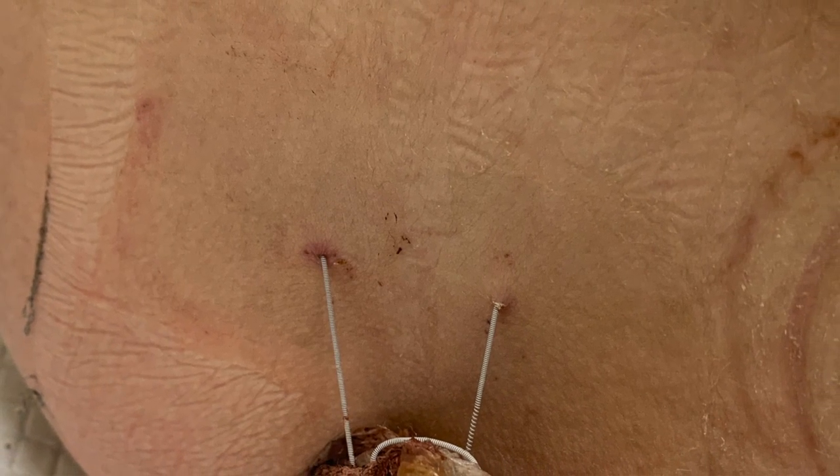The PA did take a picture of my wires when she took the gauze off before she cut it. So I'll go ahead and show you guys that picture so you can see what it looks like. I didn't know that the wires were coiled. So when she pulled it and cut it, it probably snapped back into my body. That's the way I picture it in my head.